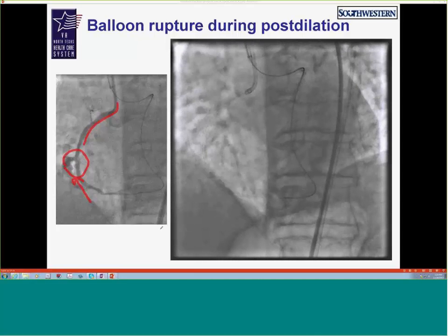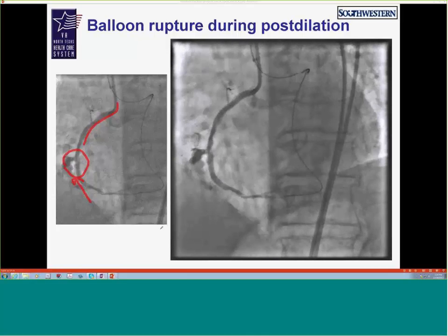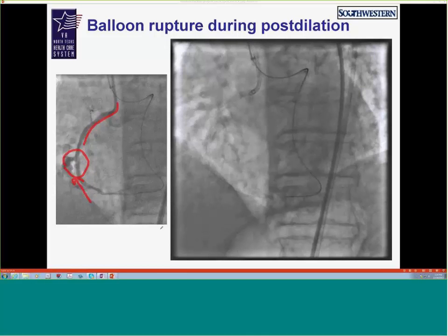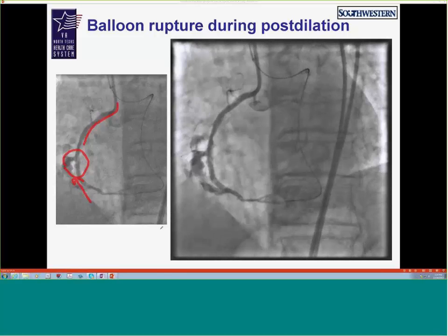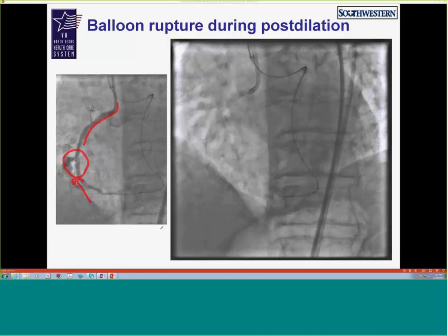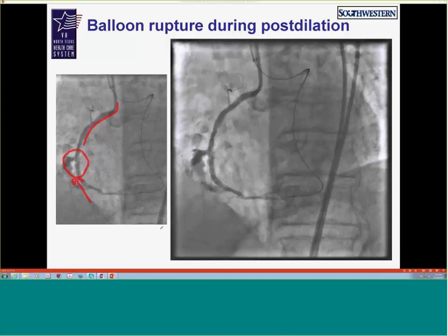However, the issue we had is I could not get, so actually initially it was fairly contained. I was able to get the balloon down for a while. And if you look at the picture, although it looks pretty ugly, it's not free flowing into a cavity. It's going into some sort of structure.